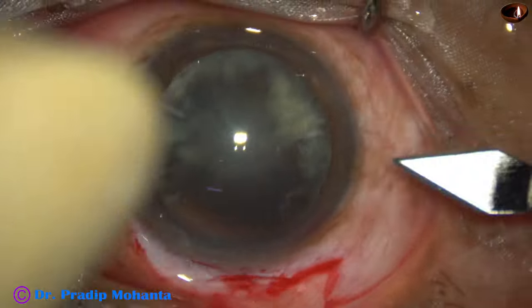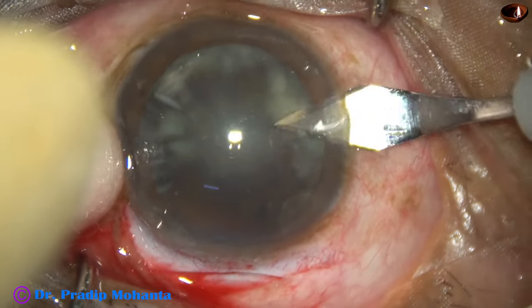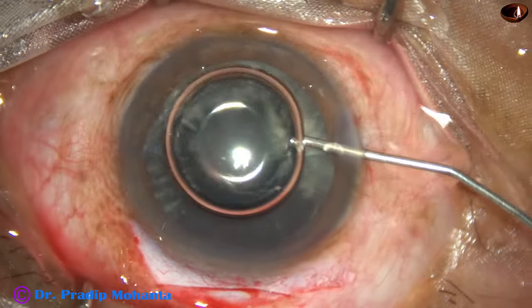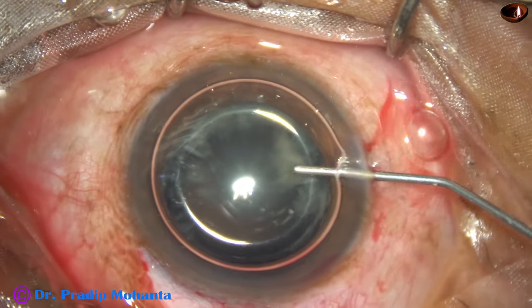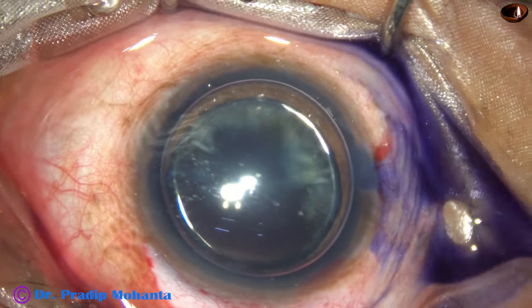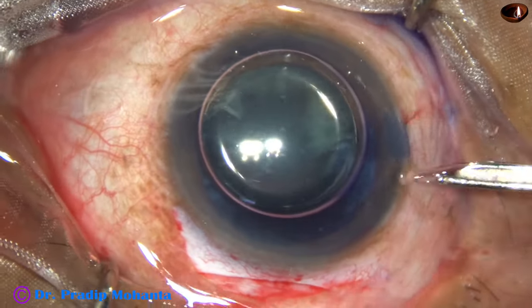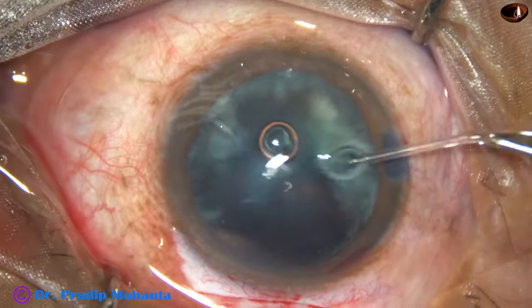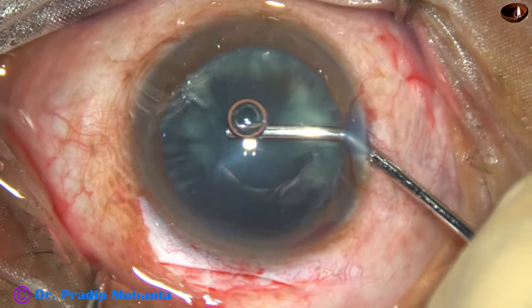Now this is a side port at 8:45 o'clock or 9 o'clock. Air bubble is injected. Trypan blue dye is applied over the anterior capsule. Visibility becomes much better if we get contrast, so this dye will help in increasing the contrast and it will help in doing the rhexis. I always remove the excess dye, and then I inject visco — 2% hydroxypropyl methyl cellulose.